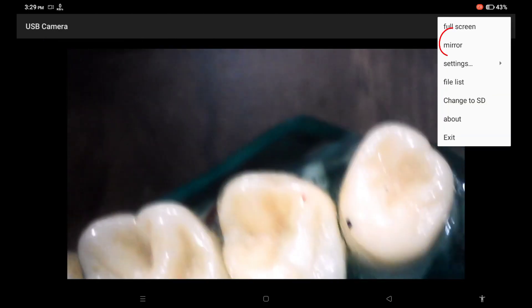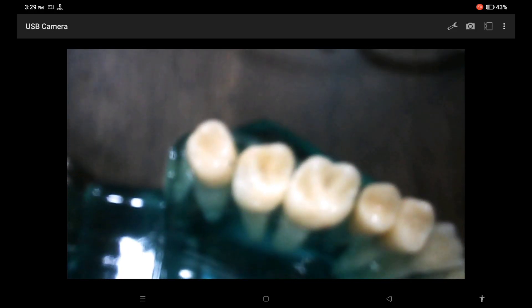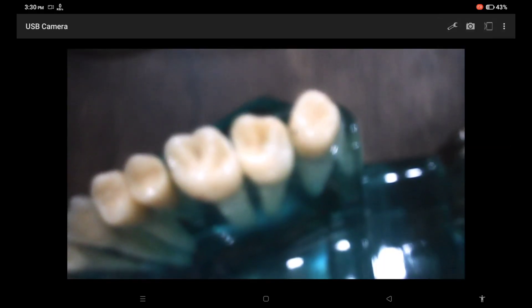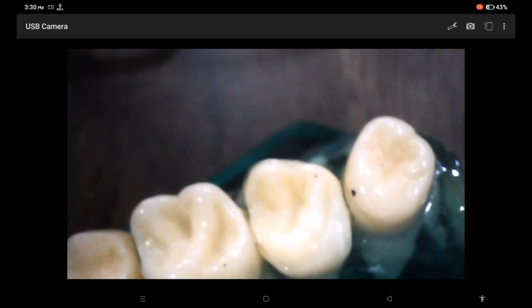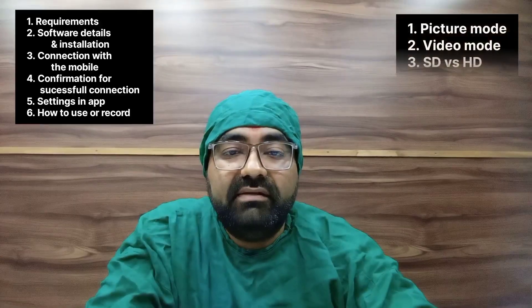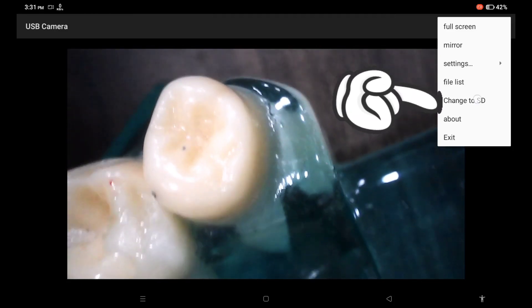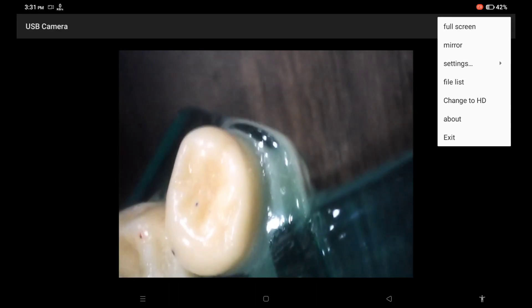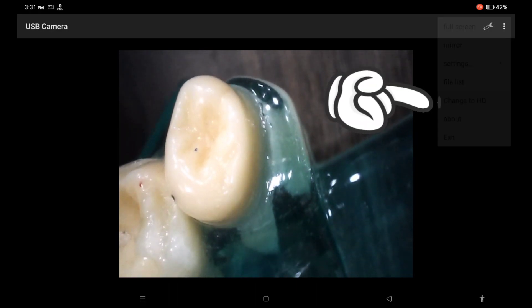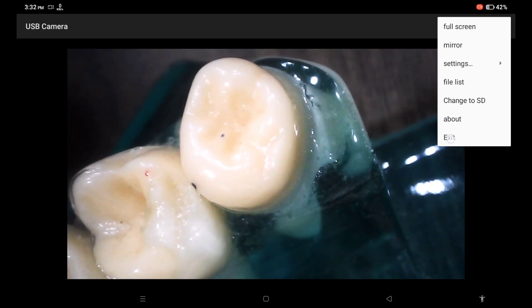The mirror option is helpful when shifting from mandibular to maxillary recording. The third option is SD versus HD in video recording. I recommend recording in HD — the file size will be more and take more space on your mobile, but for mobile use the output quality in SD is very low, so it is better to use HD. If you are using a tablet you can use SD. The remaining options are not of use, and you can use the exit option whenever you want to exit the application.